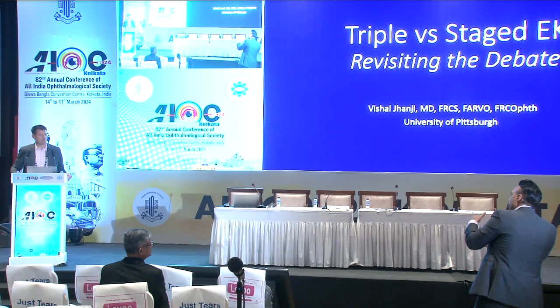And that's why in those cases, obviously we get a lot of pseudophakic cases sent to us, I'm very careful because if you shallow the AC, vitreous is going to come from somewhere, because obviously you don't know who's done the cataract surgery, right? And by definition, it must have been difficult because they've got pseudophakic bullous keratopathy. But with endo in, you avoid all that situation because you're not shallowing.